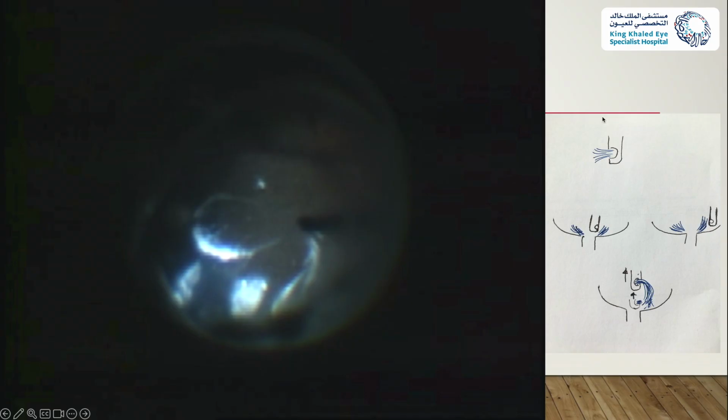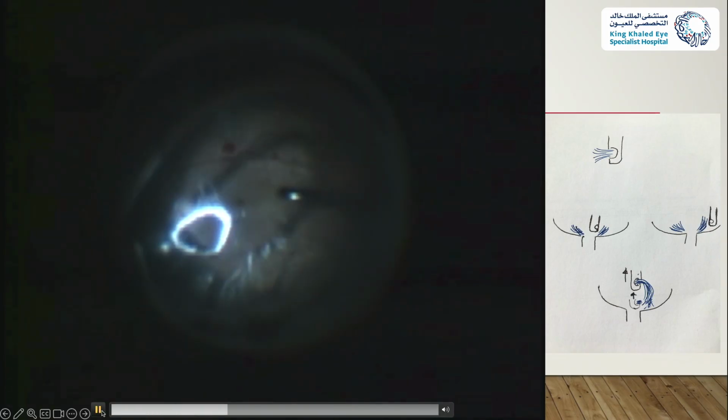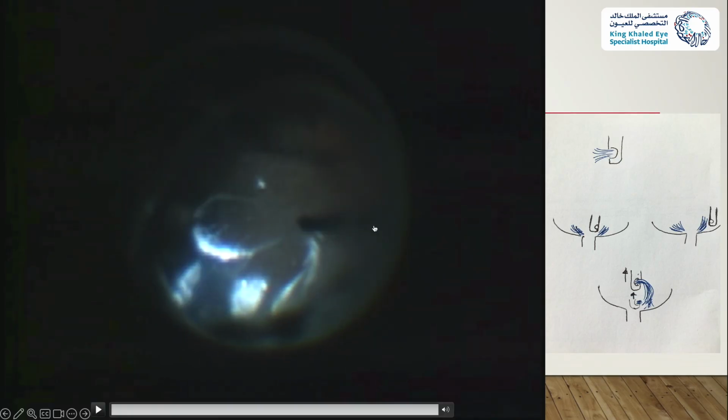In fact, the idea is that you engage the vitreous, and then you mechanically lift the vitreous from the attachment. It is the mechanical lifting that you create, not the aspiration. The aspiration is to engage the vitreous, because I've seen some trainees put the cutter right next to the optic nerve and then just push down the foot pedal and jiggle around to try to create the posterior vitreous detachment.